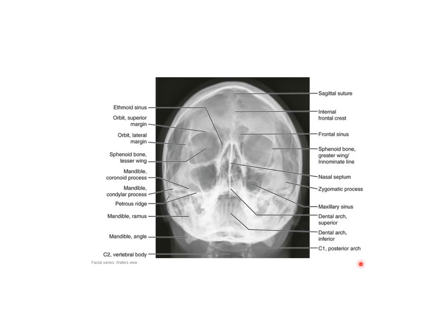This is another Waters view showing the frontal sinus, orbit, greater and lesser wing of sphenoid, nasal septum, ethmoidal air sinus just below the frontal air sinus, maxillary air sinus below the orbit, then the dental arch and the condylar and coronoid processes of the mandible.